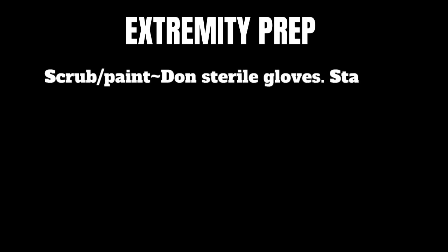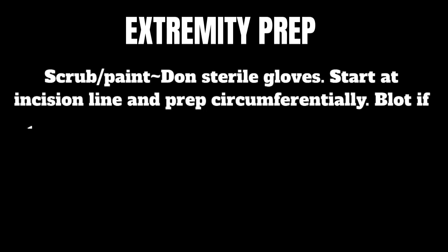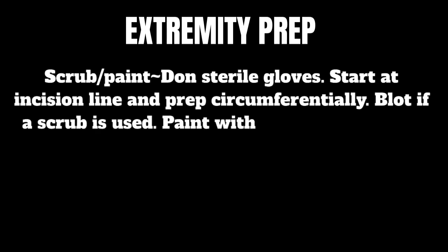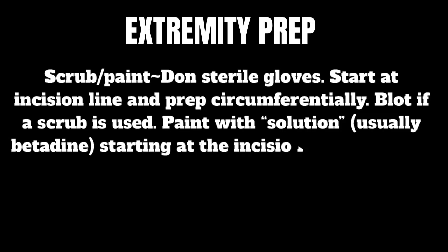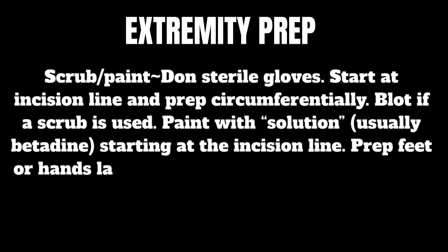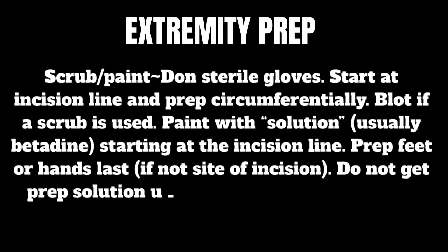Scrub and/or paint. Don sterile gloves. Start at the incision line and prep circumferentially. Blot if a scrub is used. Paint with solution, usually Betadine, starting at the incision line. Prep feet or hands last, if not the site of incision. Do not get prep solution under the tourniquet.